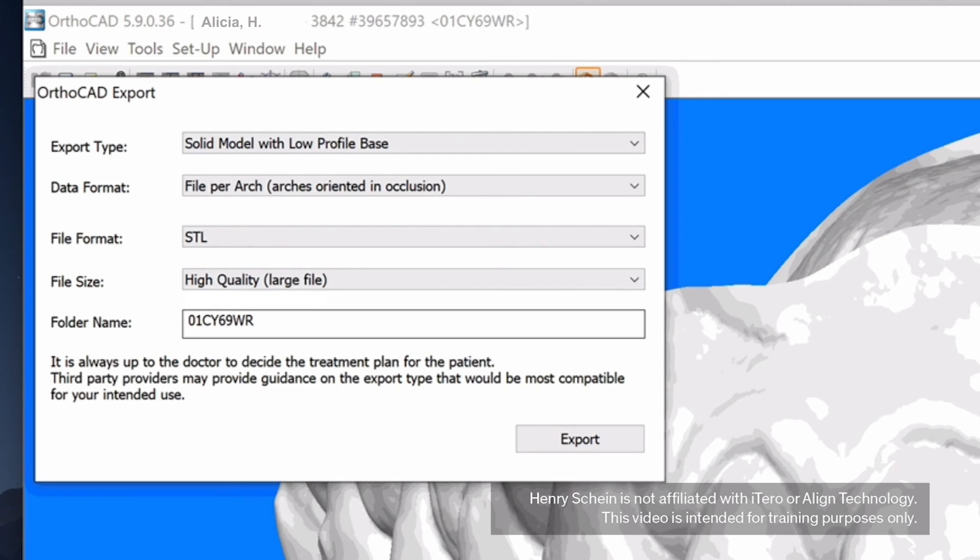To help locate the files easily, change that to the patient's name or according to the clinic's operating procedures. Click Export.